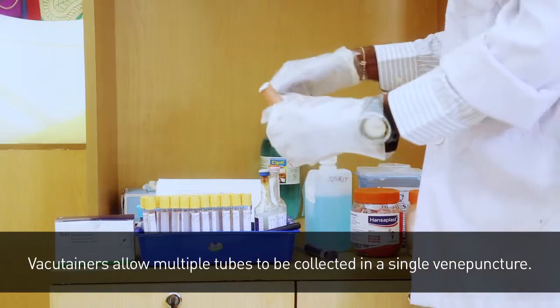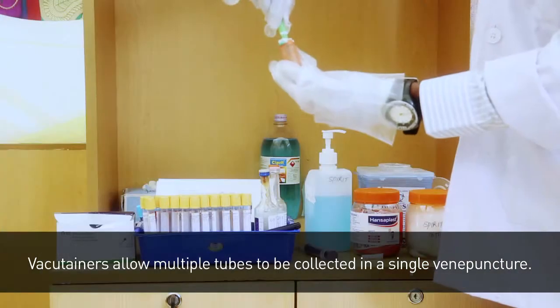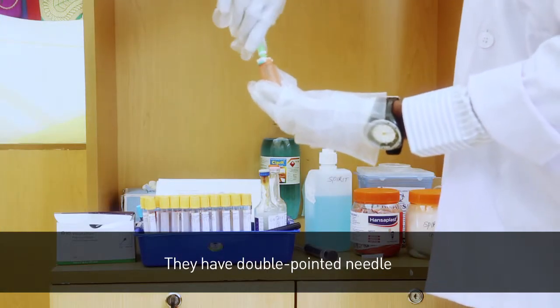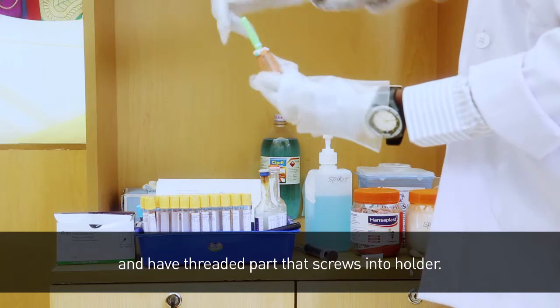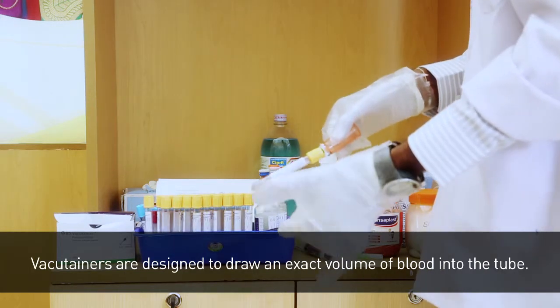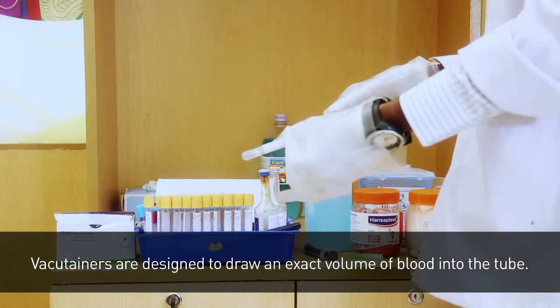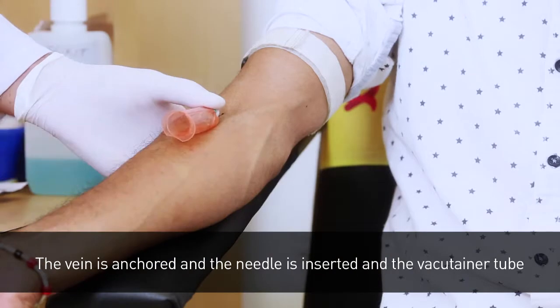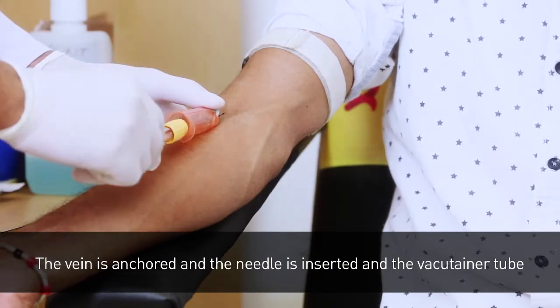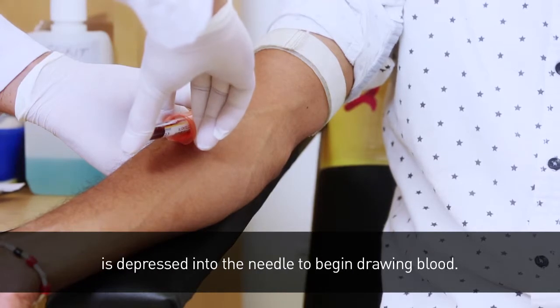Vacutainers allow multiple tubes to be collected in a single venipuncture. They have a double-pointed needle and a threaded part that screws into the holder. Vacutainers are designed to draw an exact volume of blood into the tube. The vein is anchored, the needle is inserted, and the vacutainer tube is depressed into the needle to begin drawing blood.